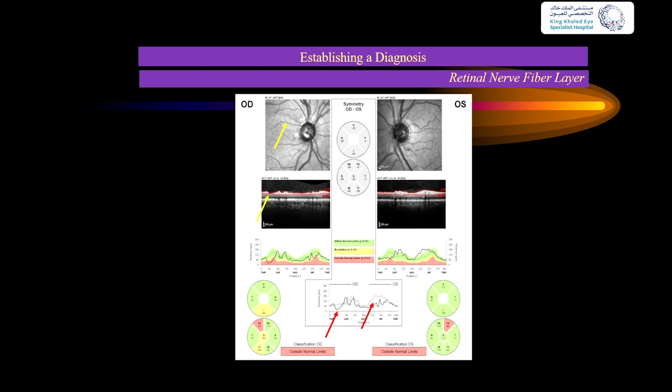One of the images that you get here in the nerve fiber layer analysis is the circle scan around the optic nerves. It's laid out here like a ribbon compared to the normative database, and then an average of all the quadrants' values is given. Most glaucoma doctors tend to want to do what I call kindergarten OCT. That is, looking at the primary colors. Is it red? Is it green? Is it yellow? And that is not what we as glaucoma specialists should do.